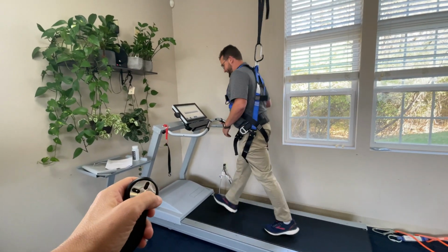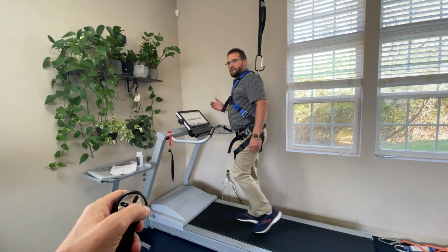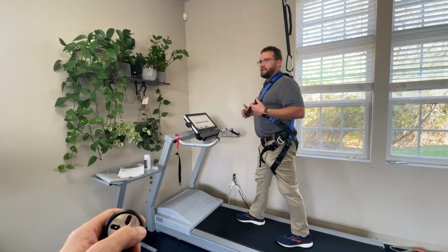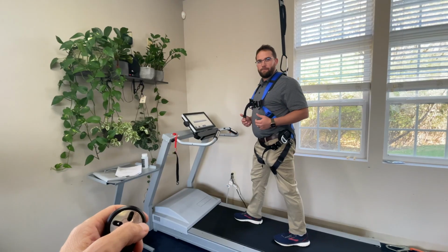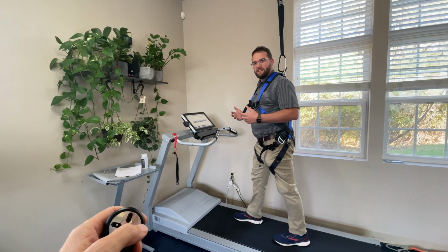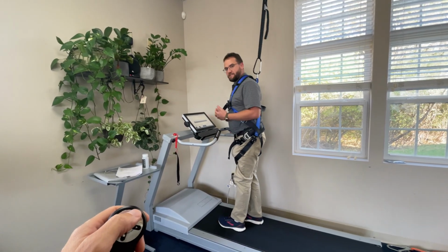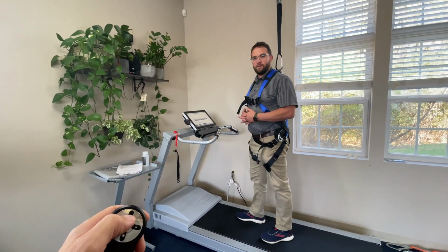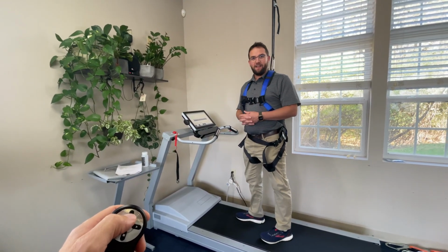So whenever he hits it again, now the way we can equate this, the purpose of this is, think about it in terms of you're walking in through the airport and you start to go get on the people mover. That initial jolt is going to actually send people walking a little bit farther forwards. So that's kind of one thing that we're using for the therapist that can help train that individual.